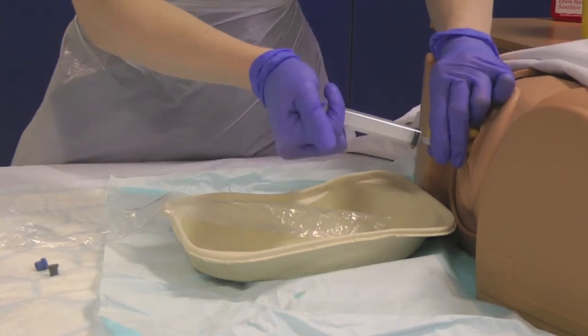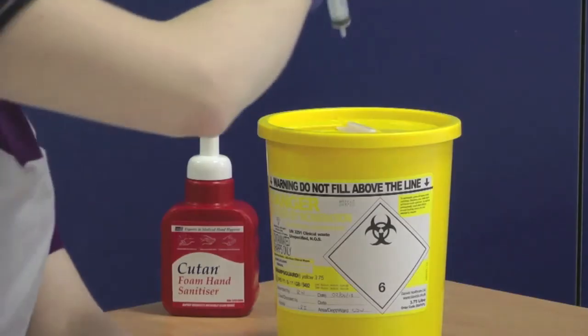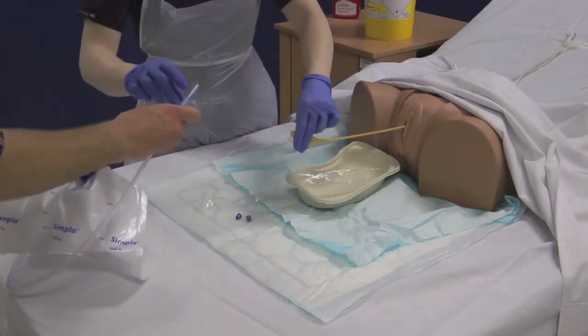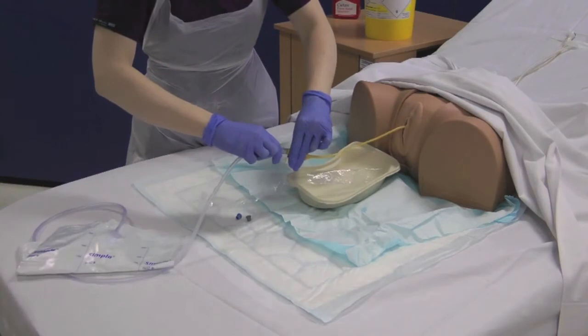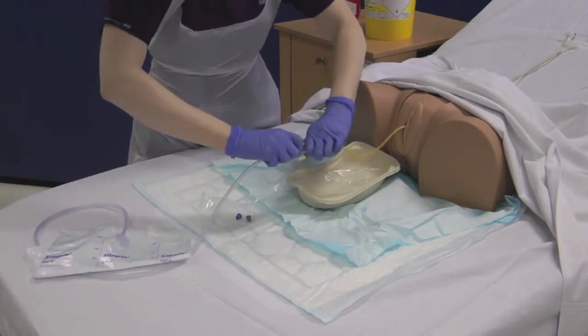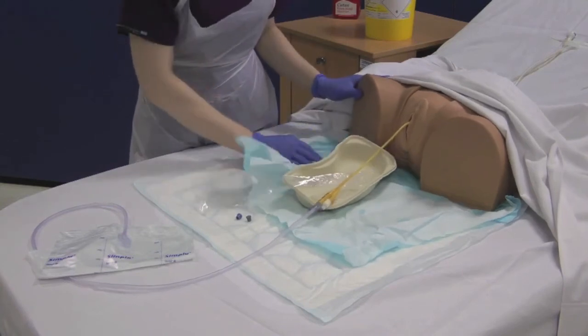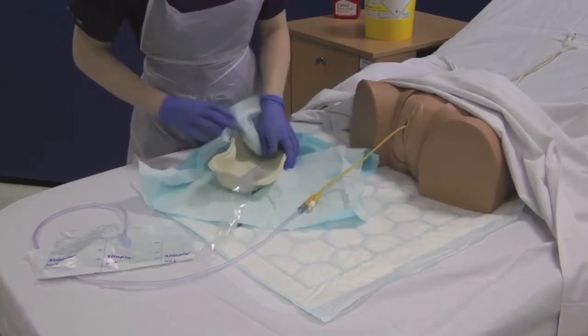Dispose of the syringe into the sharps bin. Once the balloon is inflated, withdraw the catheter gently to ensure it is secure against the bladder neck. Connect the selected drainage bag. This can then be attached to the patient's leg or catheter stand. Remove all waste material.